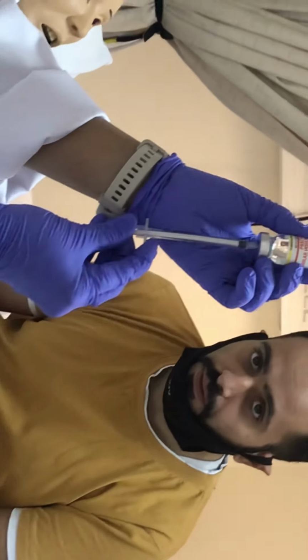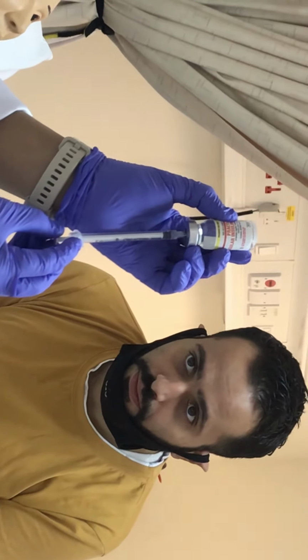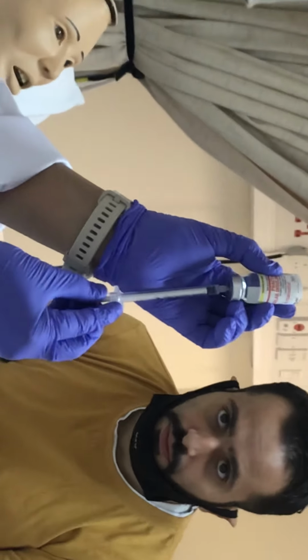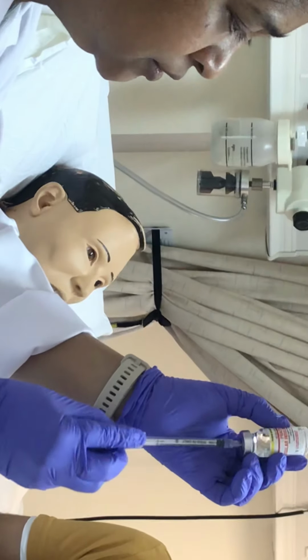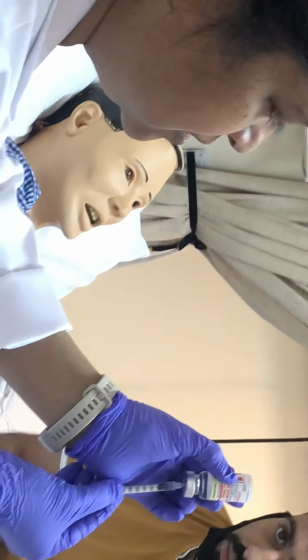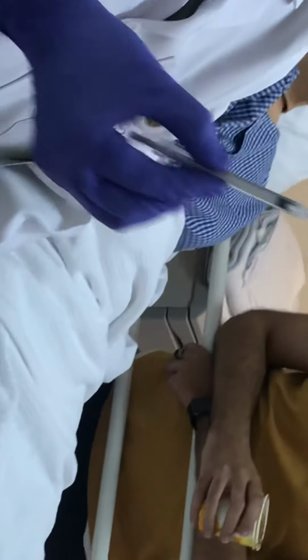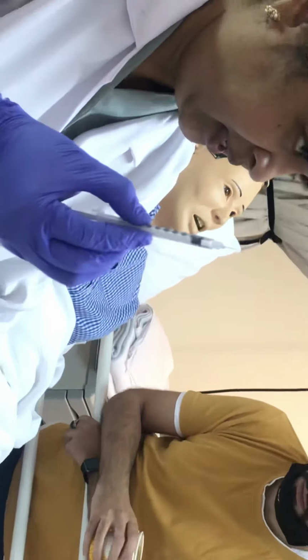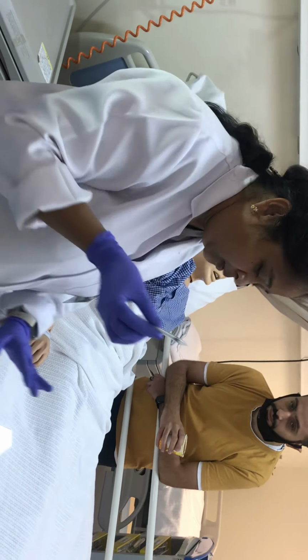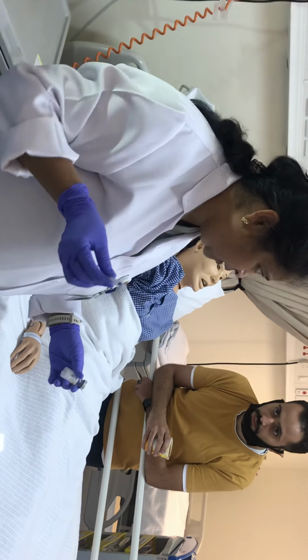We push the air, then we draw the medicine. And we have to make sure of the medicine level, maybe the vial remaining little only. The problem is there will be a lot of air coming. The students should know they should never take the air, so they should push it back inside whenever they are getting air. And my second nurse also should check that. It is 10 units. Okay. Can I recap now? No. You understand now why I did all the cleaning, preparation, everything. Now with this in my hand, I'm being very careful not to poke anybody near me.